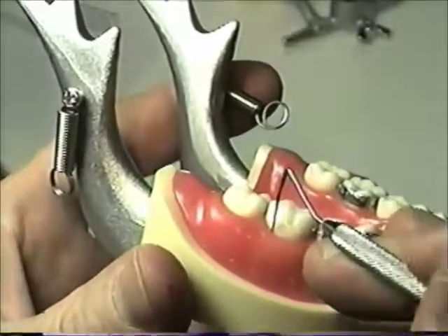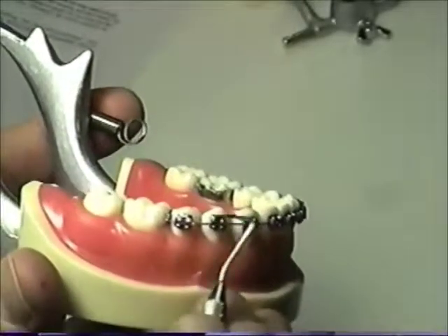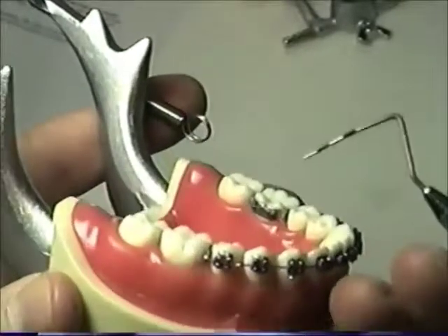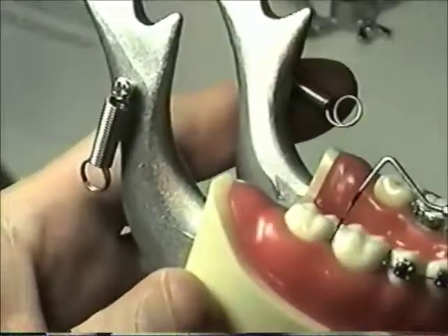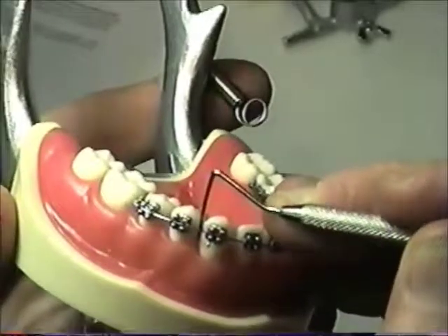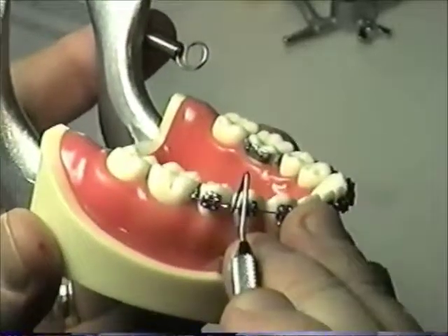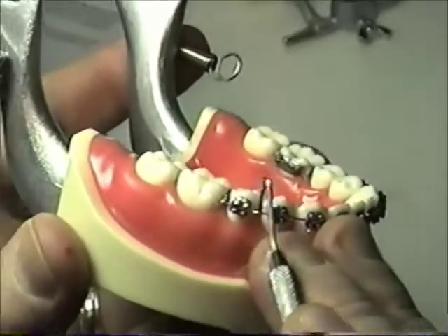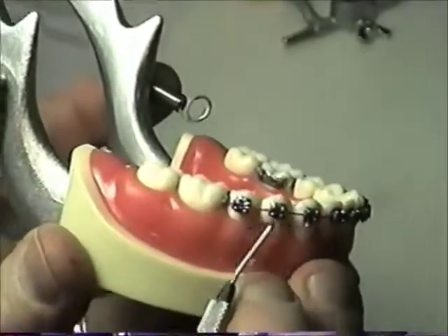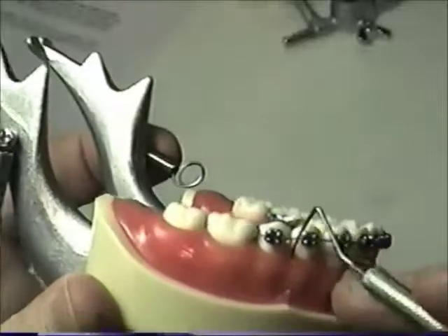So guess what? When you Waterpik, that's where you use the Waterpik. If you're just taking the Waterpik and giving your teeth and braces a shower, that ain't cutting it. A Waterpik is a machine that produces a fine stream of water that acts like this probe, and when you're Waterpiking, you need to actually get the water to shoot up under your gums just like this probe is doing, and you can feel it. So you've got to make sure that you're jamming it up under, like right there, and let the water run right where that probe is. And it's not to clean your braces. The Waterpik's main purpose is to go where this probe goes.